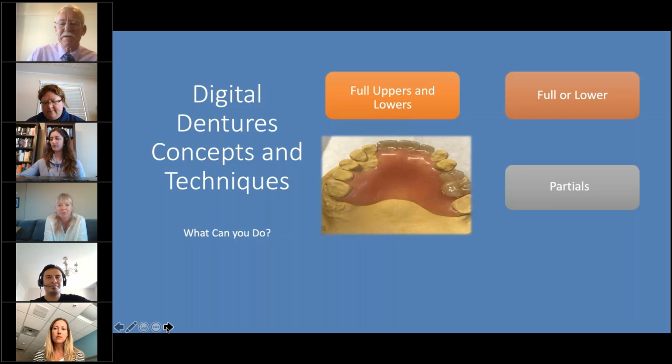That's the only thing, so you milled the base. It's not injected or anything like that. No, everything's milled, and then it's just socketed for all the teeth. The teeth are all milled, and you just bond it together, and then it's into the heat cure pot, and it's a quick polish. They work out quite good. So that's something we can talk about in the partials.